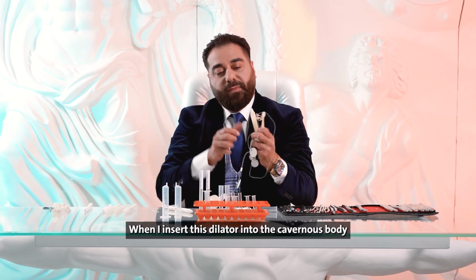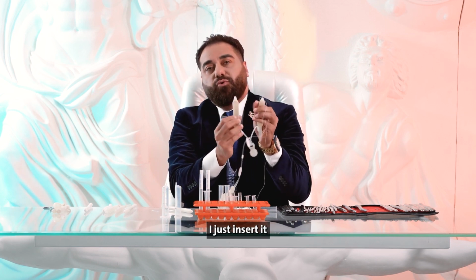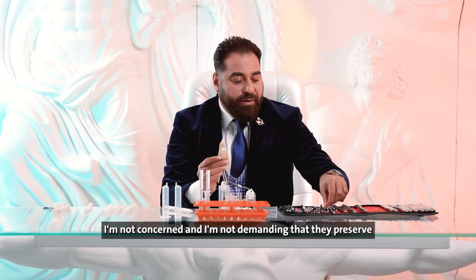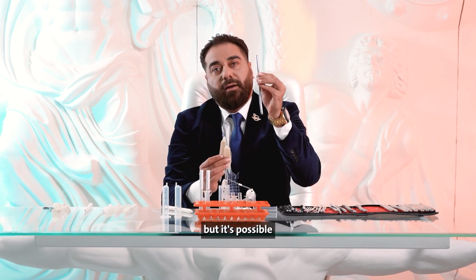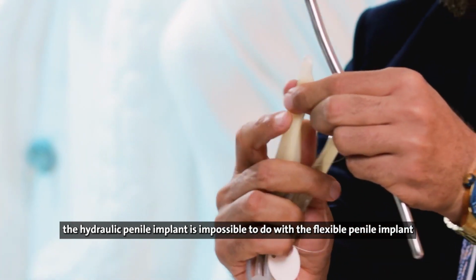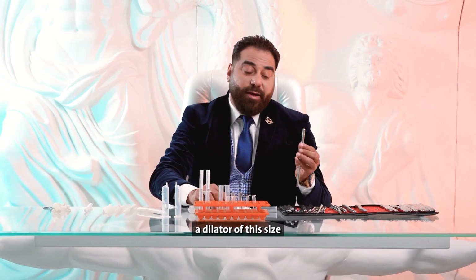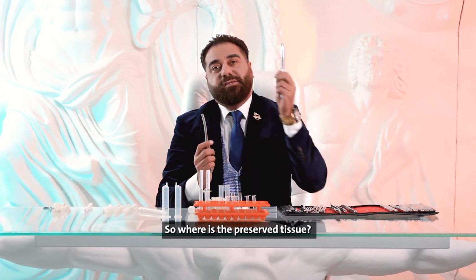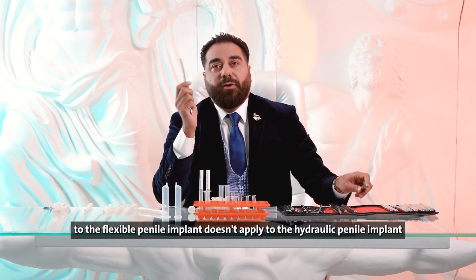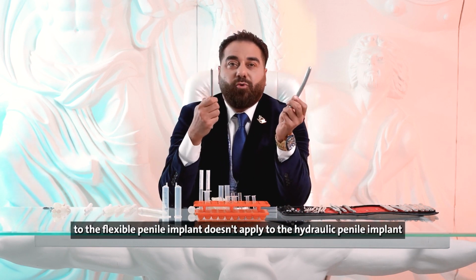How? When I insert this dilator into the cavernous body, which may have this diameter I just inserted, here I might leave a bit of tissue, nothing will happen. I'm not concerned and I'm not demanding that they preserve, but it's possible. What I can do with the hydraulic penile implant is impossible to do with the flexible penile implant. I have to insert a dilator of this size. So where is the preserved tissue? There's no tissue. This means what applies to the flexible penile implant doesn't apply to the hydraulic penile implant.